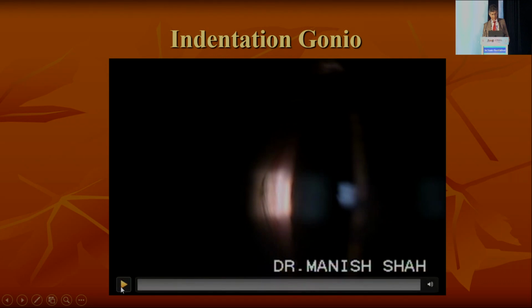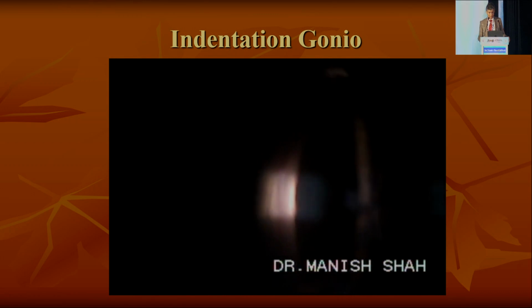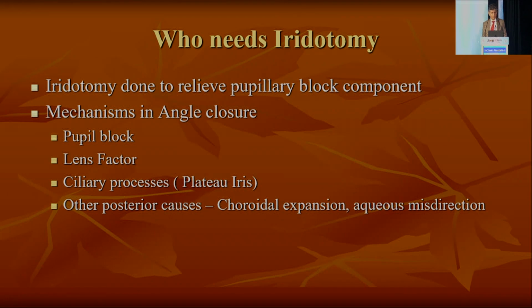So this is a dynamic video to show you the indentation effect. As you push, you can now see the angle is opening, and almost all the angle structures are visible, as opposed to the resting condition where it is not. So indentation gonioscopy is a very important tool.